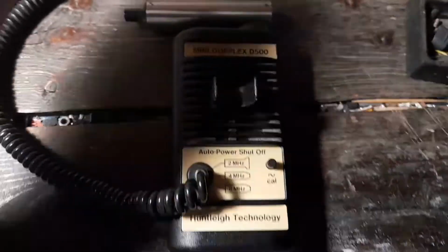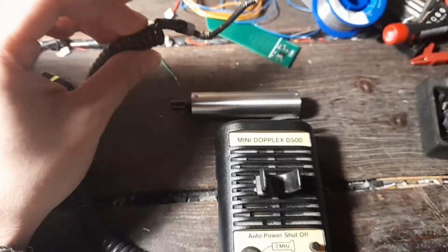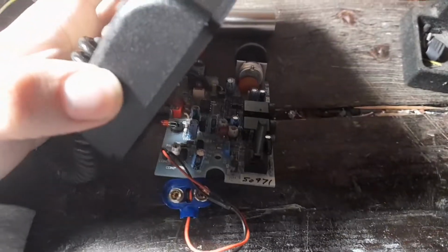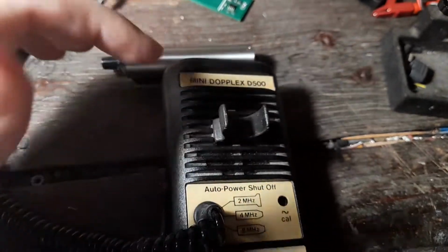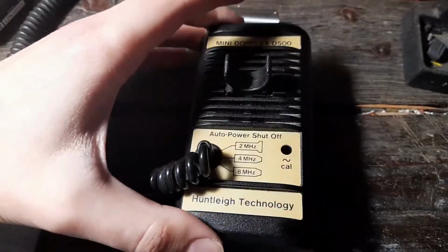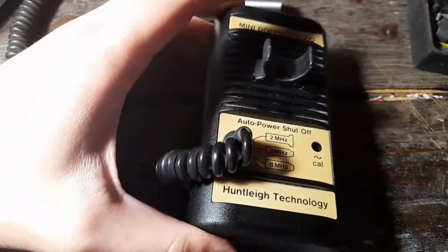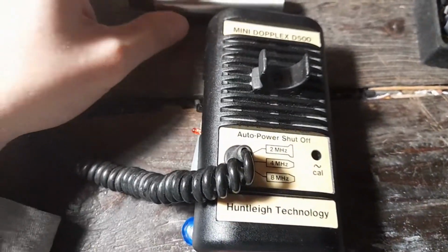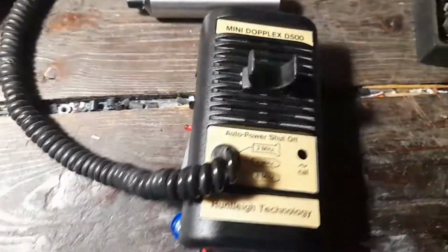The resulting Doppler shift, which in this case is audible, is then amplified by this amplifier unit, and the doctor can hear this shift, and he can also record it in a waveform and assess the state of the circulatory system he examines at the moment.